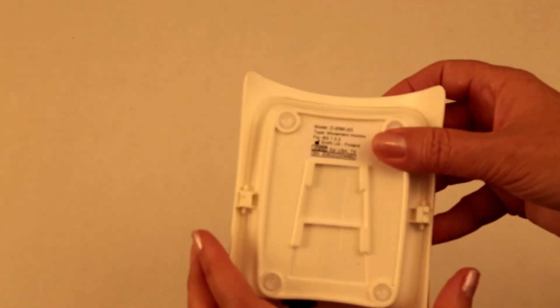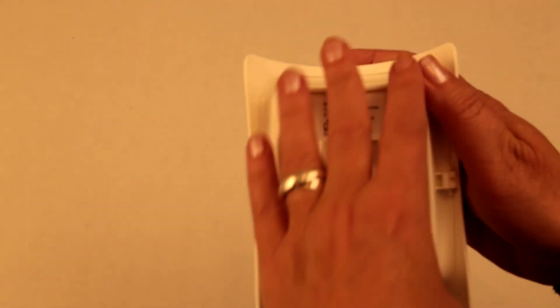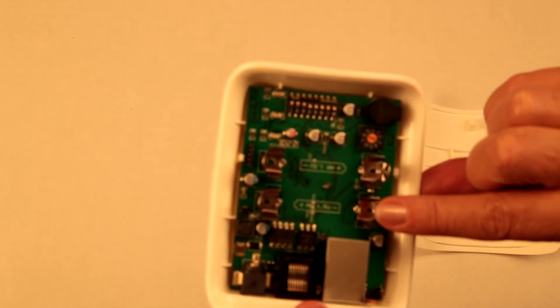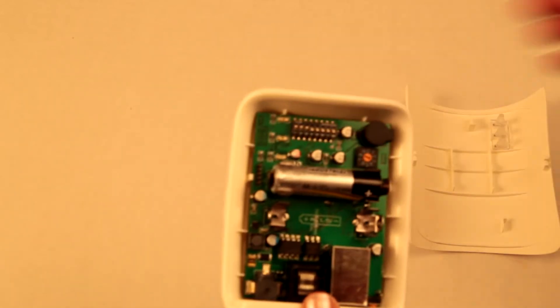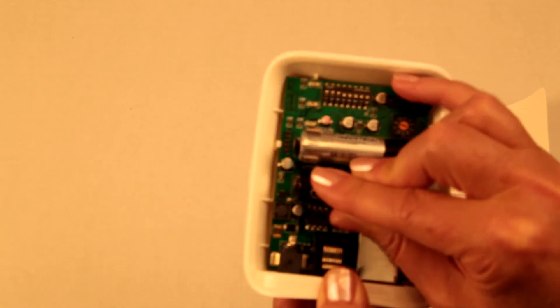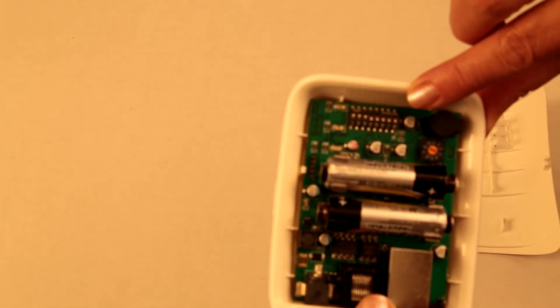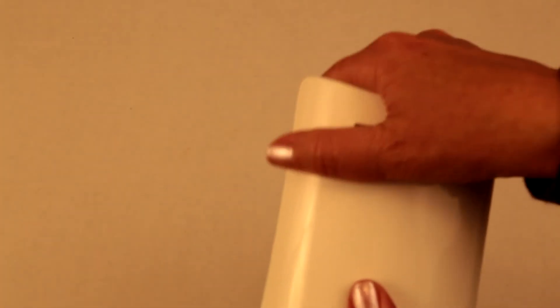Next, you'll want to open the Mfit control unit by firmly gripping one of the tabs located on either side, pull out, and lift up. Now you'll insert the two AA alkaline batteries provided according to the diagram. Be sure to press firmly in place. Volume and the preset delay will be set at the dip switches numbered 1 through 8 located at the top, and sensitivity can be adjusted at the orange rotary dial located in the upper right hand corner. Replace the lid by snapping firmly into place.